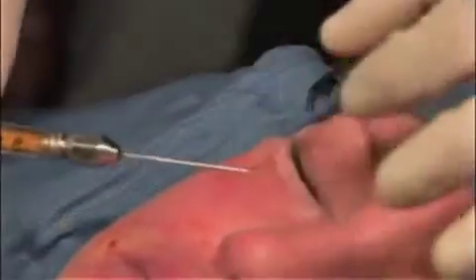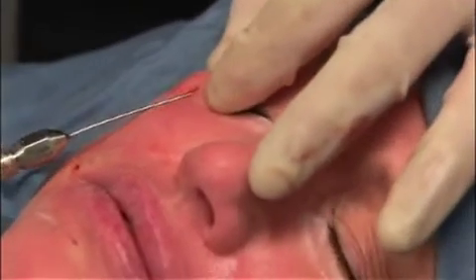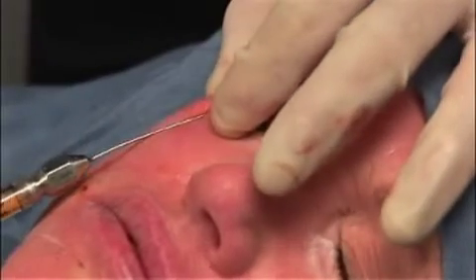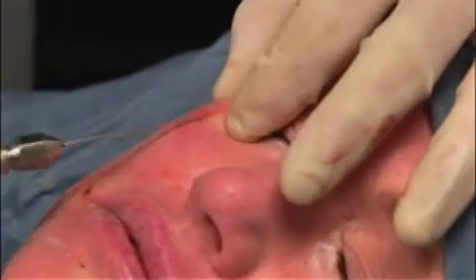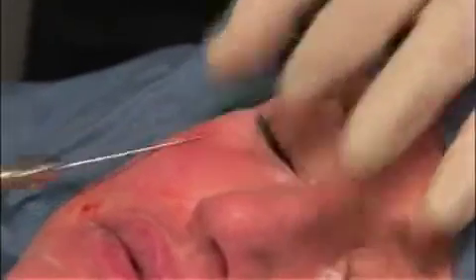I prefer to inject linear areas in a perpendicular fashion to prevent a linear augmentation appearance. As observed here, we use a very small microcannula measuring 1.2 millimeters in size to inject very small aliquots of fat.